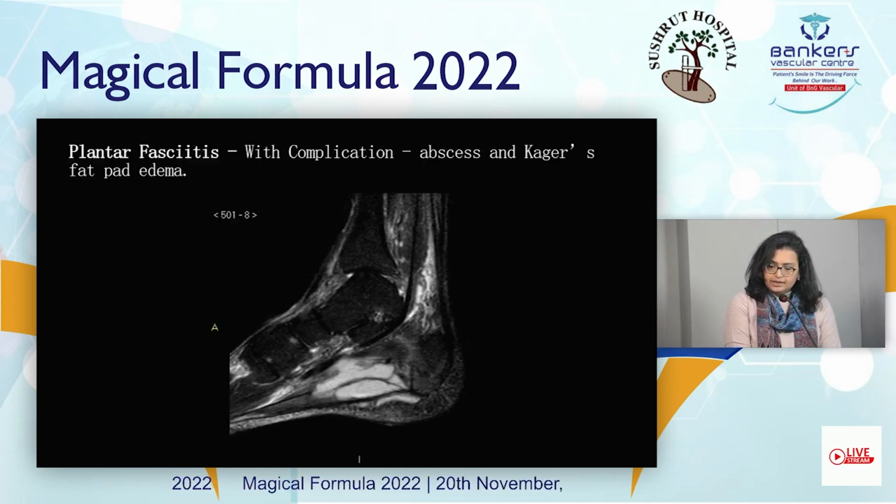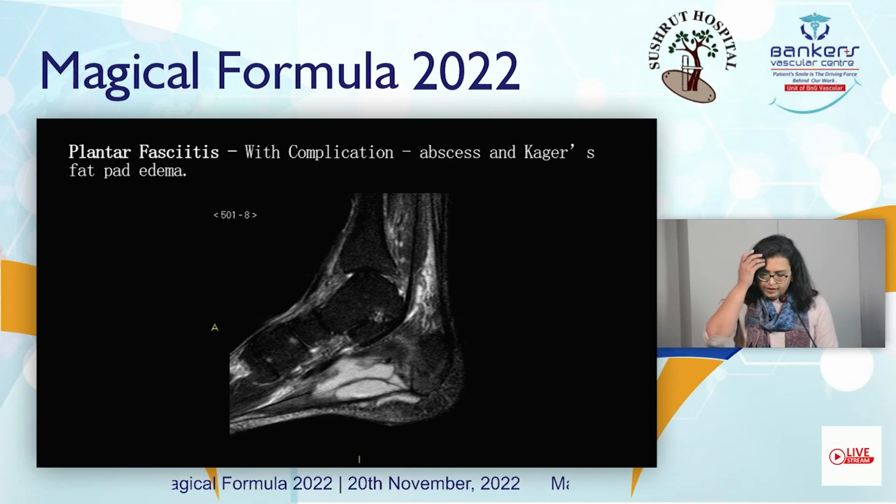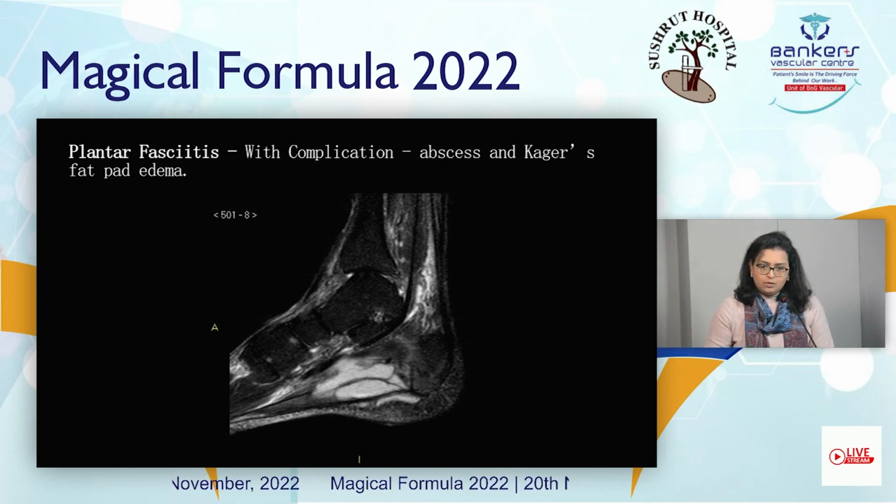This is an example of one of the complications that can occur, wherein here it is engulfed by an abscess and there are other inflammatory changes in the Kager's fat pad. This is not per se plantar fasciitis, this is rather a complication and abscess.